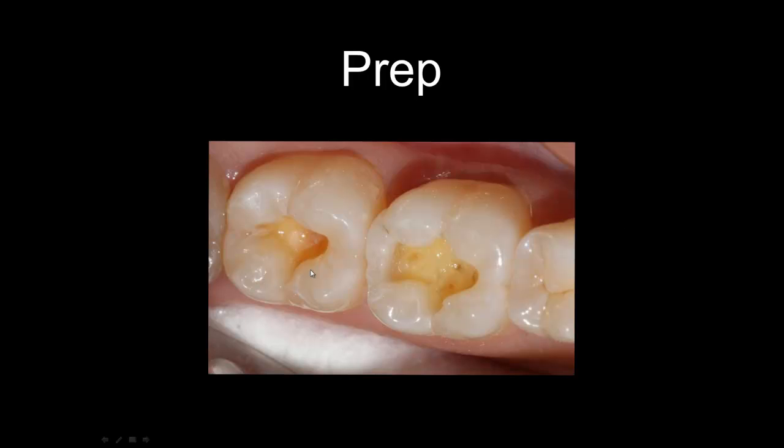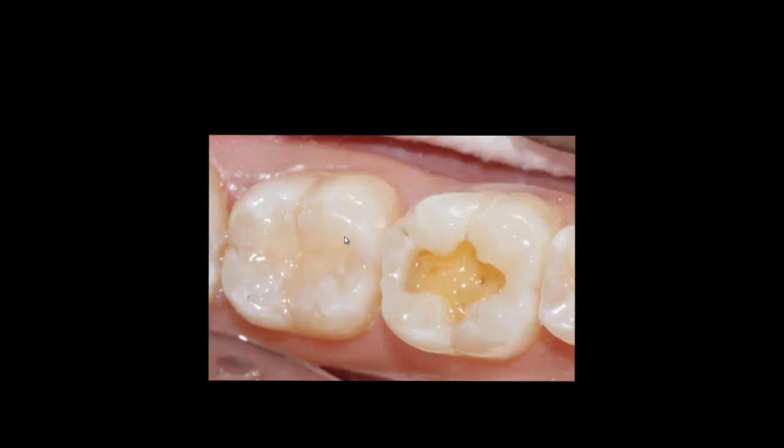Since I have a deep cavity on number 31, I use Unist M2 as a liner material — I think it's the best material to protect the pulp and it's very easy to use. With PrepStart, I use 27 microns of aluminum oxide and 40 PSI of pressure. I don't use much pressure because I don't want to remove unnecessary tooth structure, just clean the dentin and avoid contaminants during preparation.